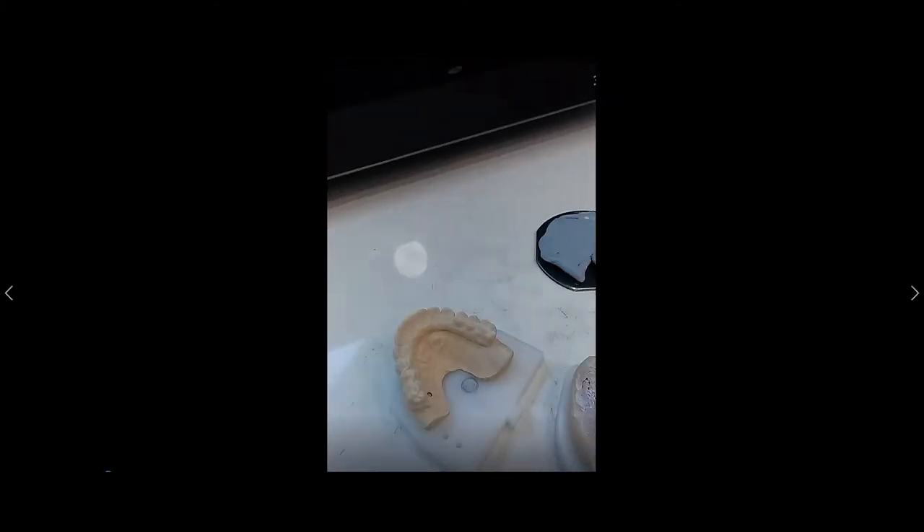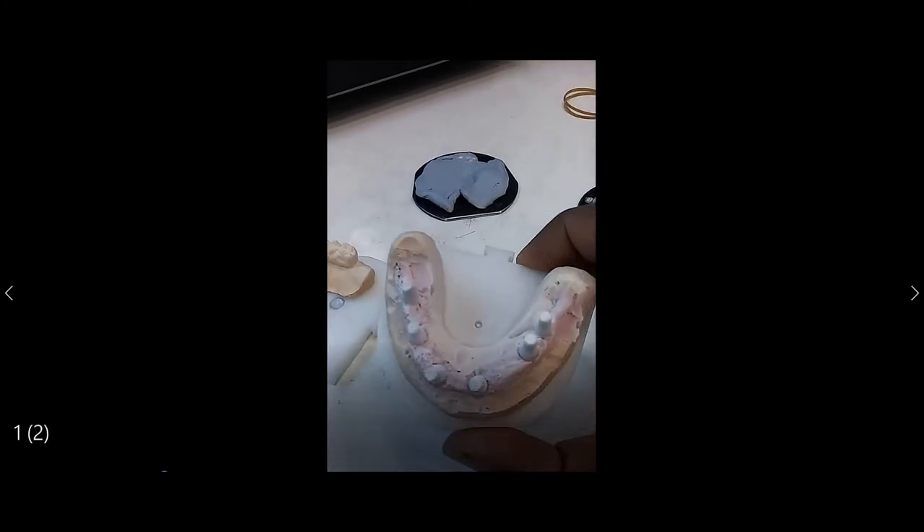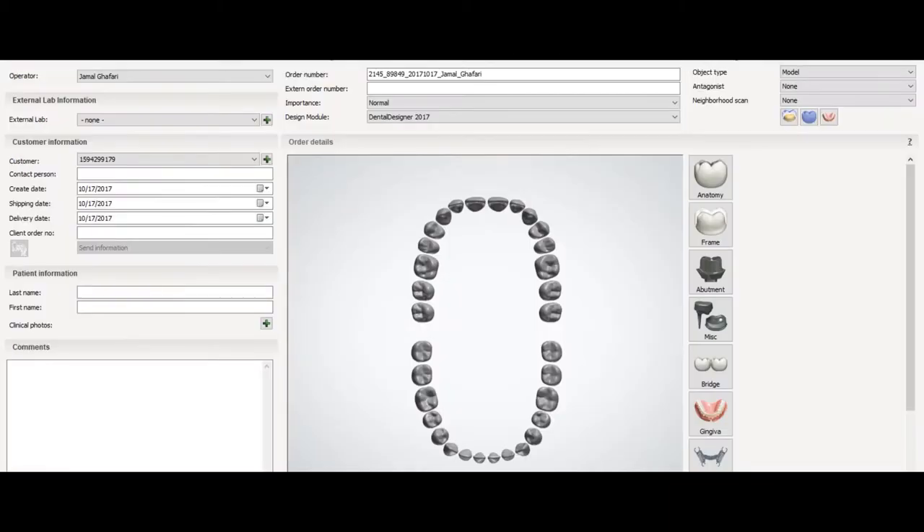We will first create an order — first you create the order. This is the lower model, so we have here the relevant teeth.